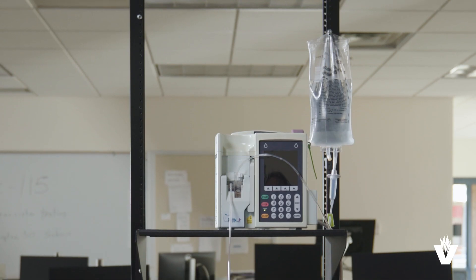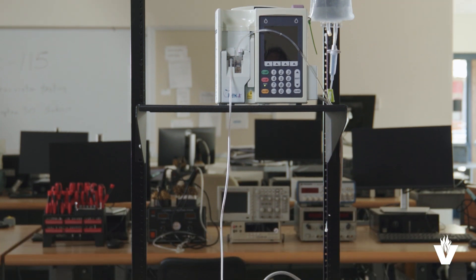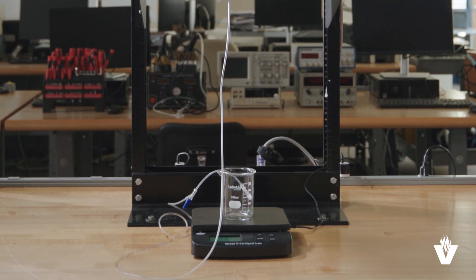Welcome. I'm Frank Lewis, an instructor in the Biomedical Department of Vincennes University. In this video, we will look at what is required to put together an IV pump test station.